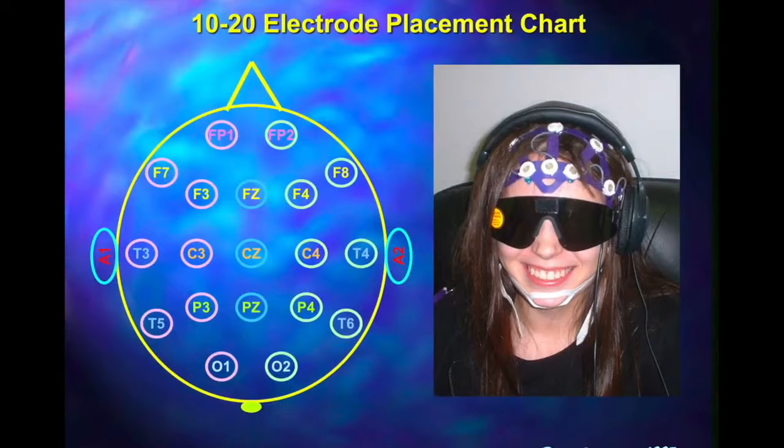Now, when we do an EEG, we use this type of apparatus. We have a headband, as we can see in this picture here, on a person's head, and we pick up all the brain waves at these different sites. And we have frontal site, central, parietal, temporal, motor strip, occipital, prefrontal, and so on, and two ear reference electrodes called A1 and A2.